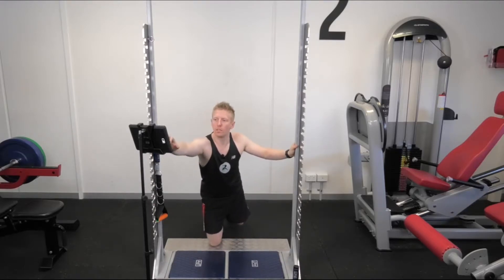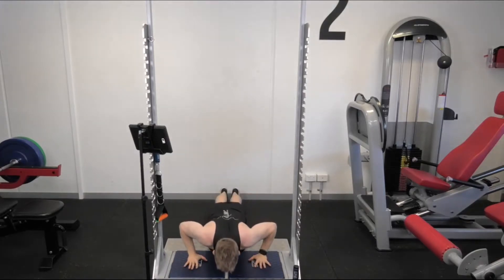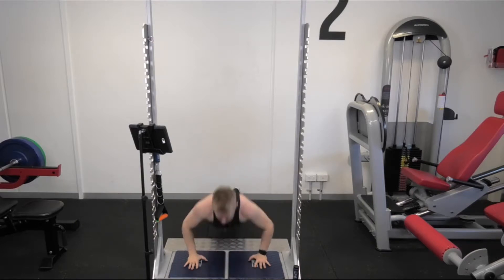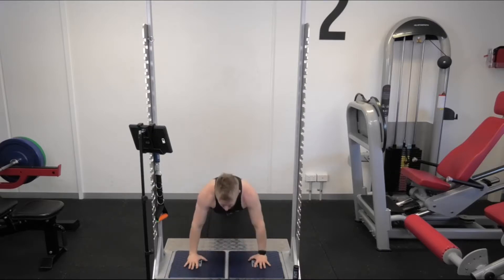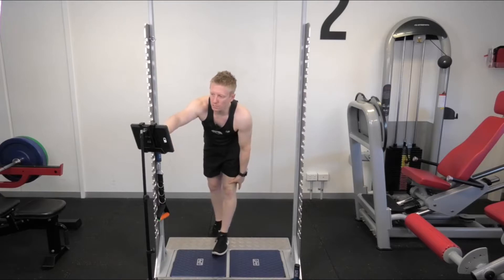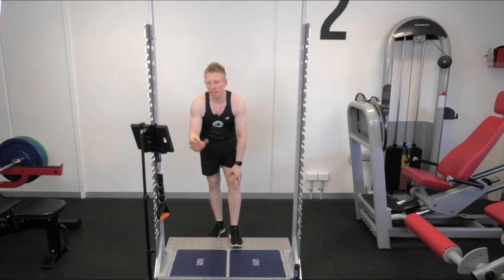Let's look at a paused push-up. I'm going to go down into a pause position, hold for two seconds, and then push up as fast as I can — three reps. That shows about 10% more force through the left side, and rate of force development is reasonably similar on both sides — about 3% higher on the right, so pretty similar both sides.